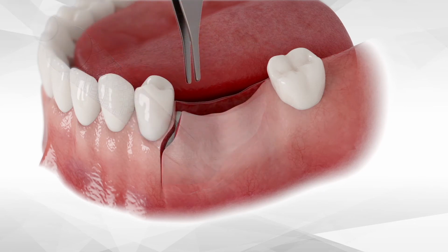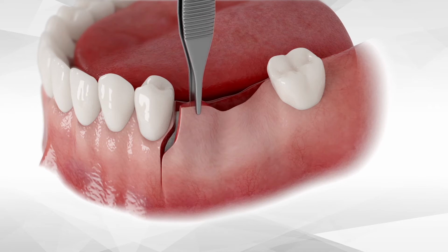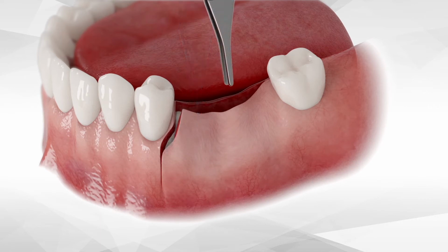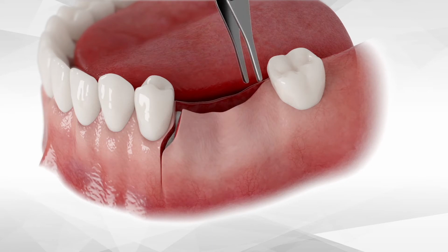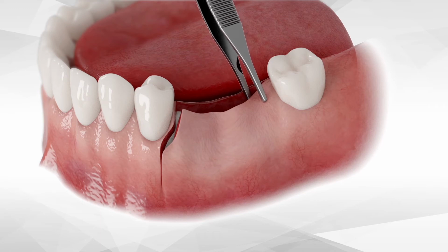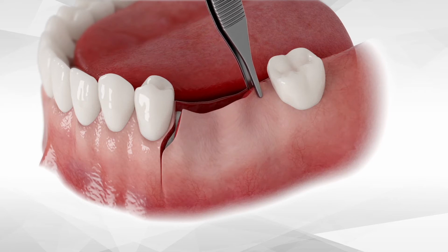Once flap elevation is complete, grasp the mesial corner of the flap and stretch, then the middle part of the flap and stretch, followed by the distal part of the flap and stretch. Reflecting 3 mm into the mobile mucosa will enable the flap to be stretched at least 6 mm. Stretching of the flap is something that is not taught with traditional grafting techniques. However, with Bond Apatite, no periosteal releasing incisions are recommended. Instead, the flap covering the graft has to be under tension.